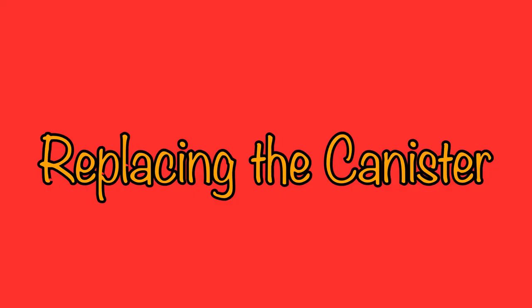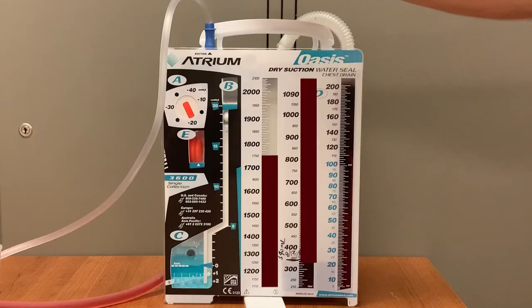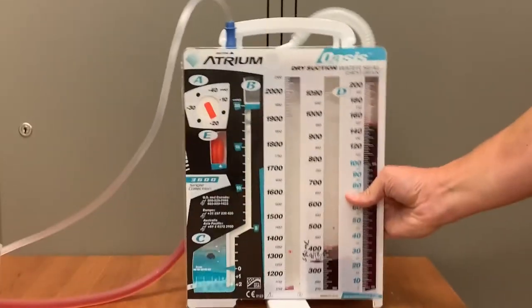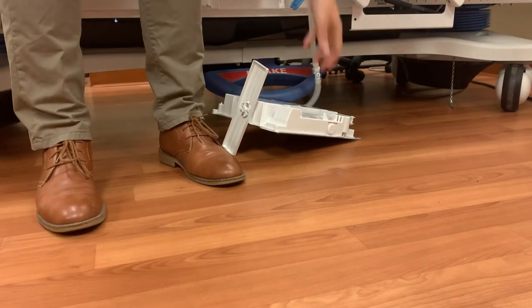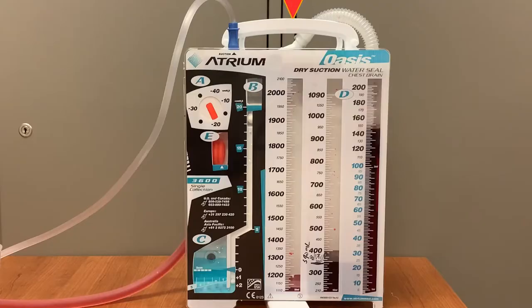The nurse is expected to replace the Oasis canister in certain situations. If the container fills to the 2-liter capacity, a new Oasis system would need to be attached to the patient. If at any point the container is knocked or tipped over, the Oasis must be replaced. If you see the container get knocked over, obviously you'll know it needs to be replaced, but oftentimes the patient kicks it over accidentally when the nurse is not in the room. If you look at the drainage columns and see fluid in the second or third columns when the previous column isn't filled to capacity, that is a clear indication that the system was knocked over and will need to be replaced as soon as possible.